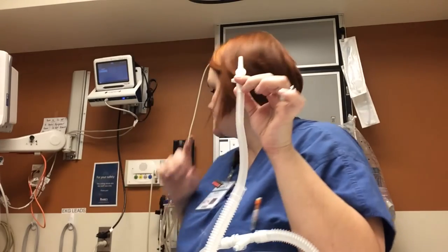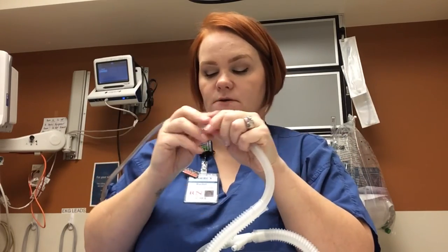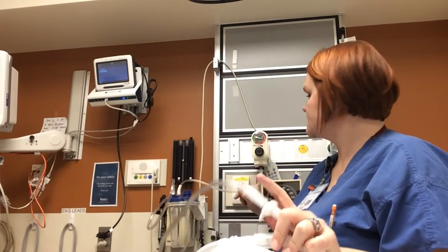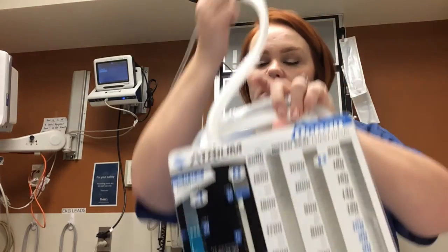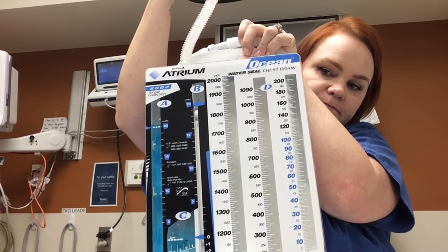And now you're ready to set it up to suction. Again, this was our first piece that we had. We're going to take our wall suction and make sure this is in the off position, or that there's no suction going through, and we're going to connect the two. You want your wall suction to be completely open or on high. So once it's on high and ready to go, now I can adjust this to a low bubble or low percolation, some people will call it. And so that's what I'm looking for right there.